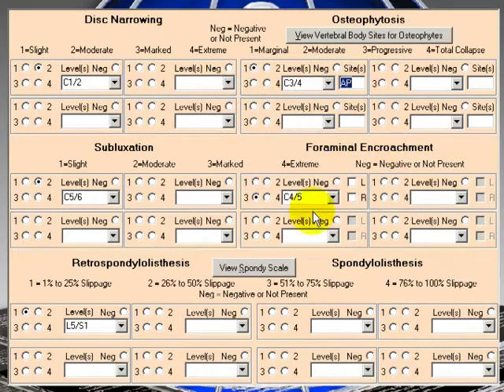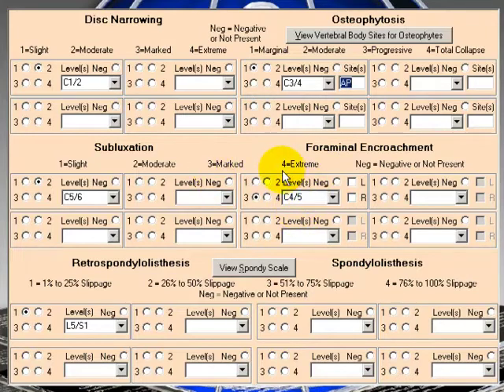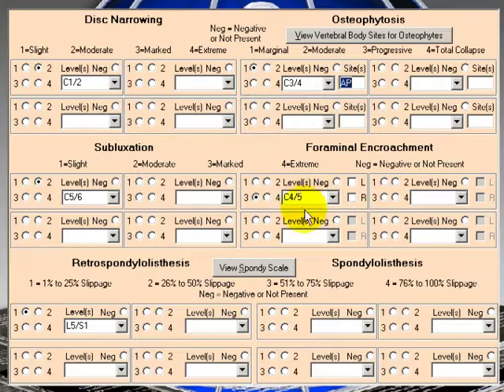And then foraminal encroachment, what do we have here? Marked foraminal encroachment at C4 to 5. We don't have anything for spondylolisthesis.